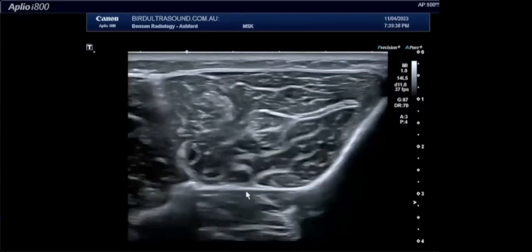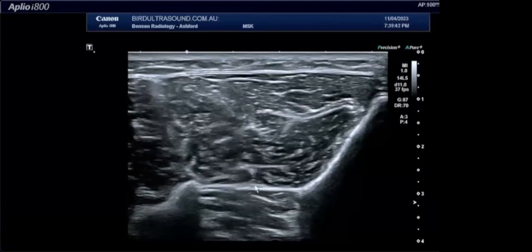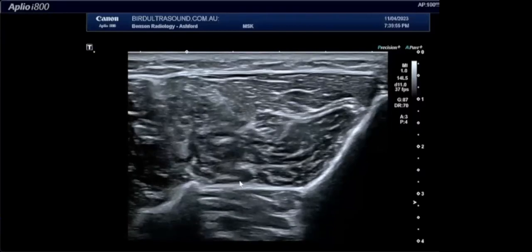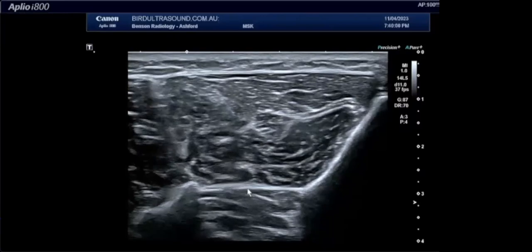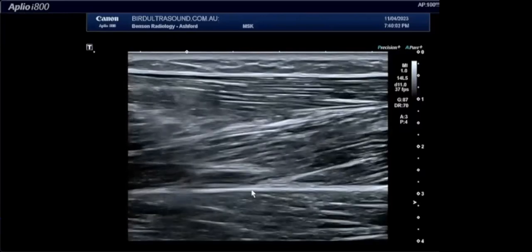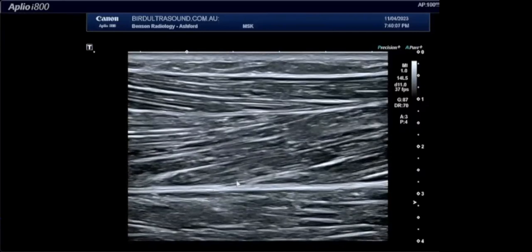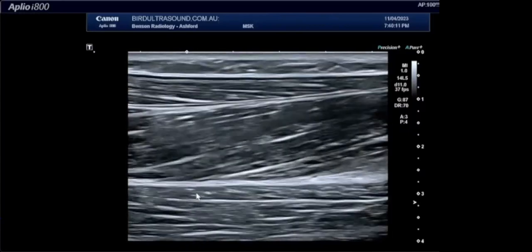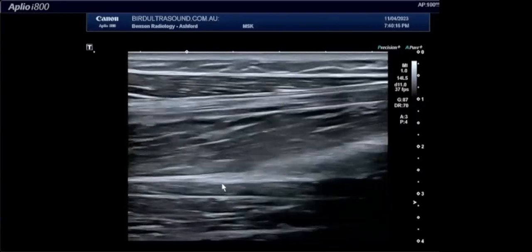When you see such an injury, you'll see there's obviously a gap here, but you'll also have a hematoma that sort of straddles across the borders from one side to the other, heading from this anterior compartment through to this posterior compartment. You can see a rather large artery here, and this is the anterior tibial artery here. You can then turn long axis on the same interosseous membrane, and while you tend to lose your anatomical bearings a little bit because it just all looks like muscle now, you know that this layer through here is the interosseous membrane, and you can walk up and down it in the long axis now, just looking for any evidence of any perforation or failure of that membrane.